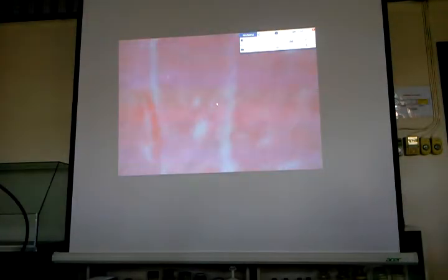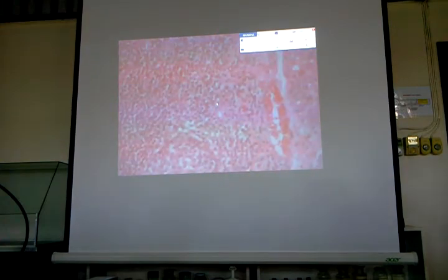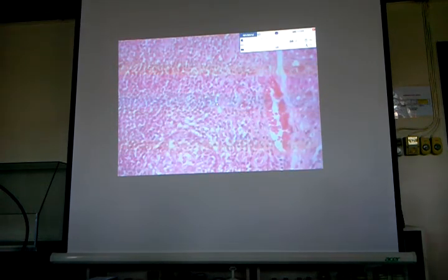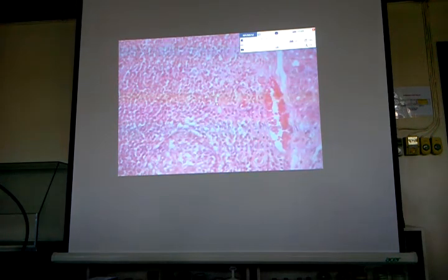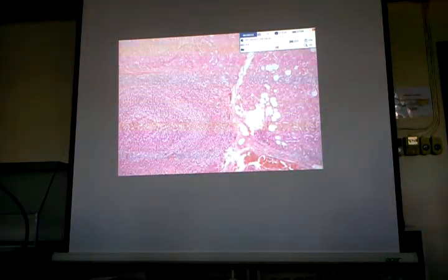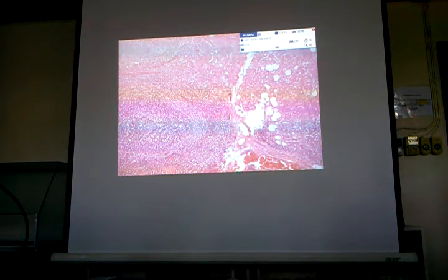The problem of this salivary gland is that it is infiltrated by those cells. Are those cells epithelial cells? They are actually lymphocytes. Large nucleus, very scant cytoplasm. Now there are areas showing us the effacement of the regular salivary gland histology due to the infiltration of the lymphocytes.